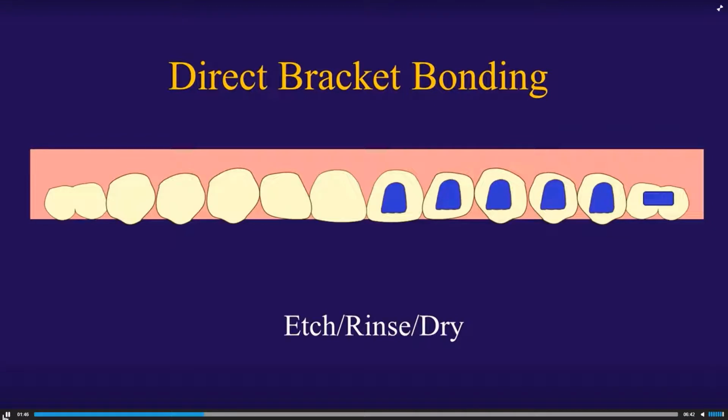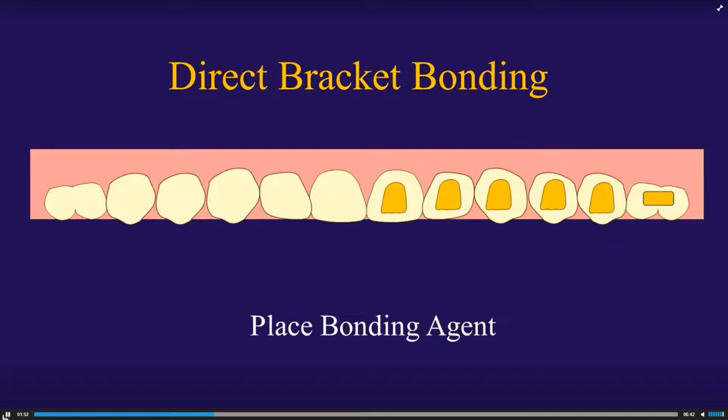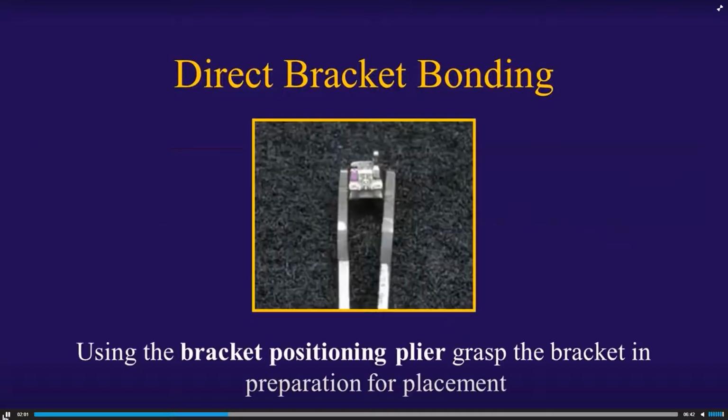So you etch, rinse, dry the teeth that you're doing your direct bracket bonding on. Now place your orthodontic bonding agent. And again, I don't cure it. I cure the bracket and the bonding agent all at the same time. Now you're going to have that bracket preloaded in a reverse action bracket holder. Reverse action means when you squeeze, it lets go. I like this much better than cotton pliers or tweezers, something like that. It can be locked and loaded, ready to go.